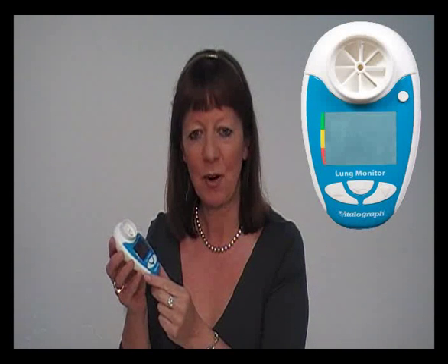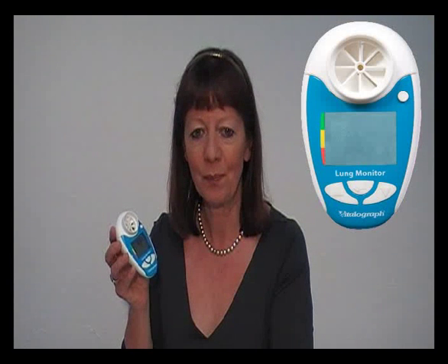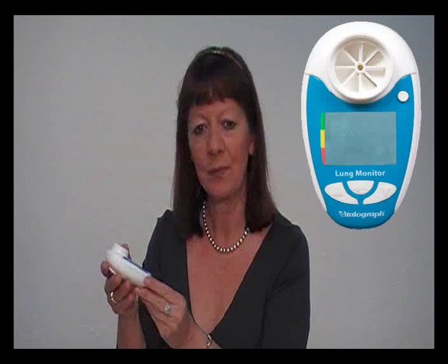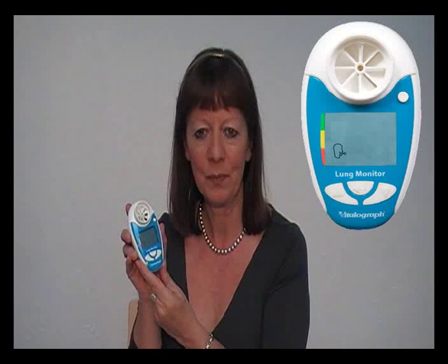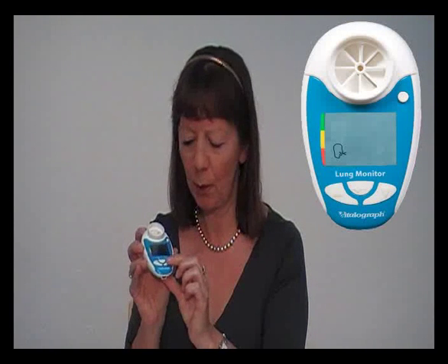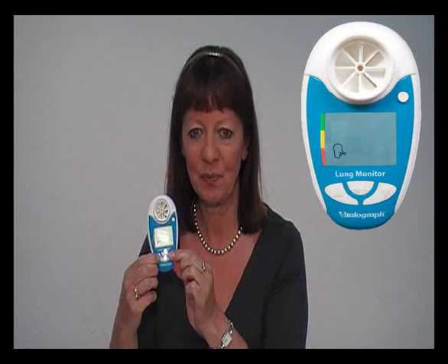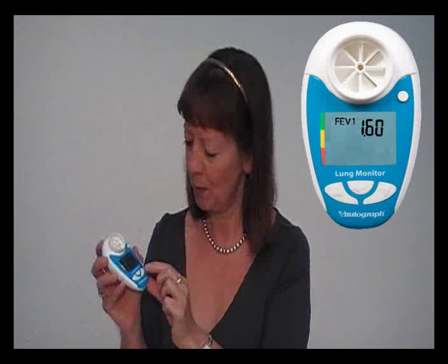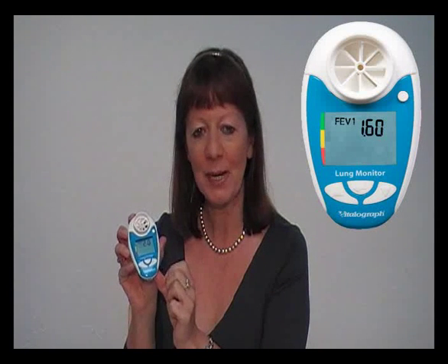With the Vitalograph Lung Monitor, you also have the facility to enter your own personal best measurement for FEV1. In order to do this, simply switch on the Lung Monitor and then hold both the up and down arrows together for 3 seconds. Use the up arrow to scroll up to your personal best FEV1 and then press the enter button.